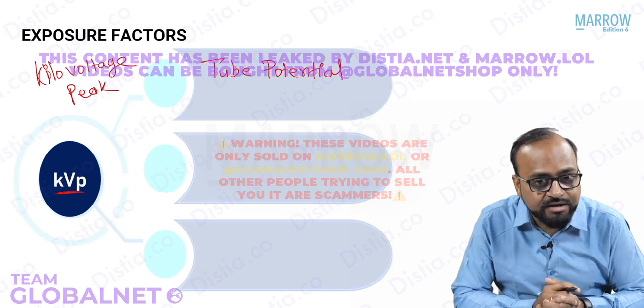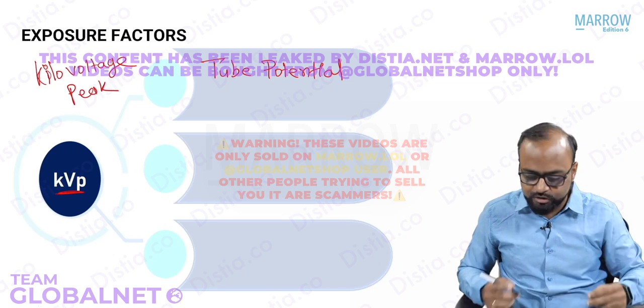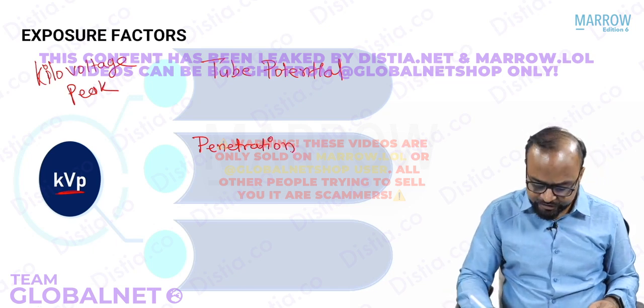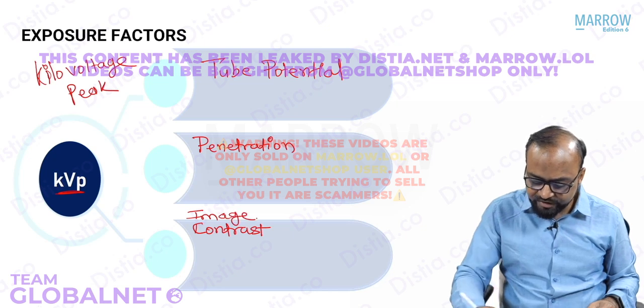So what does it affect? Remember, when we change the KVP, it affects two things. One, it affects the penetration of the X-ray beam, and two, it affects the contrast of the image. How does it affect penetration?